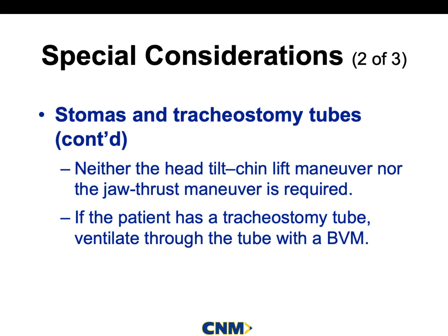Again, guys, this is a direct line to the patient's airway. This is a hole in their trachea, right? This is probably the most secure airway that you can have as a person, right? A hole drilled right into the trachea. Very little air movement is needed in order to get that air down into the lungs, okay? So that being said, remember that this is the patient's airway. The head tilt chin lift or jaw thrust maneuver is not going to work because we bypassed the nasal pharynx and the oral pharynx, okay?